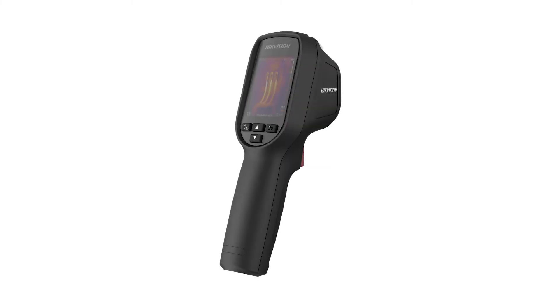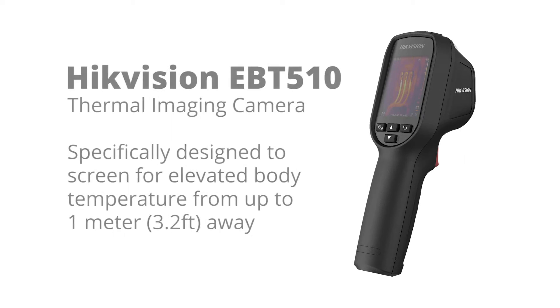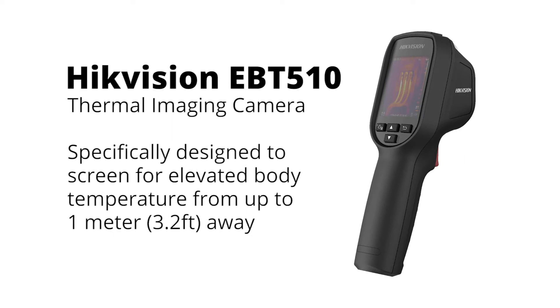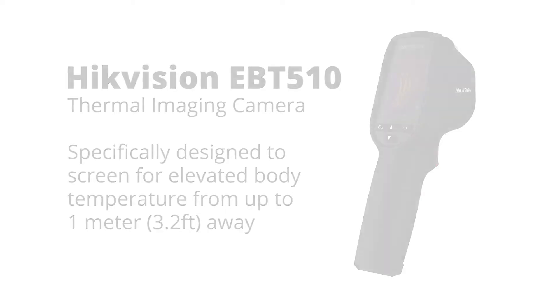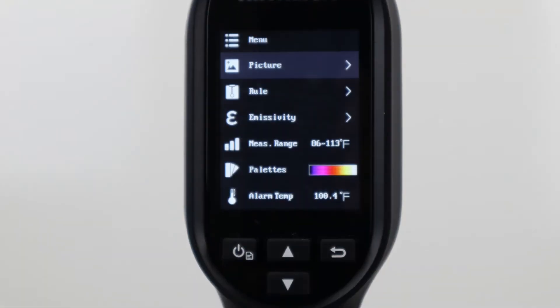The Hikvision EBT-510 has a simple menu which you can use to change a variety of camera settings like measurement units, color palette, alarm temperature, and more. To access the menu, press the power button once.